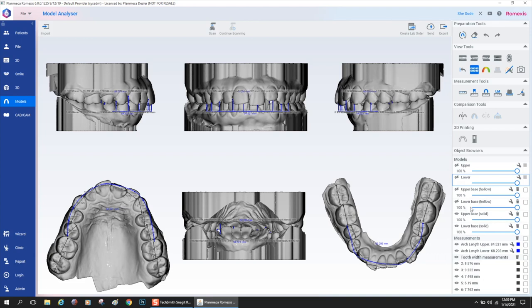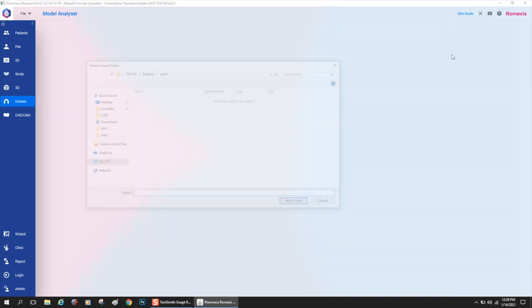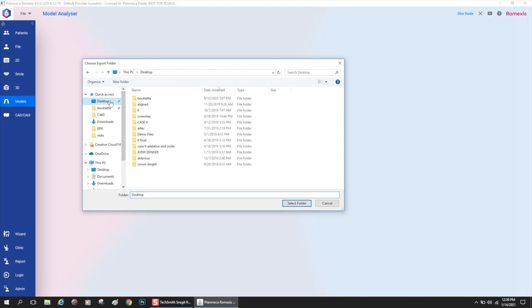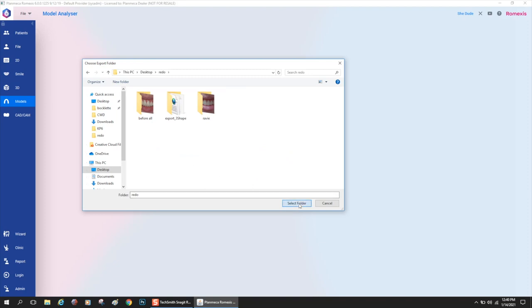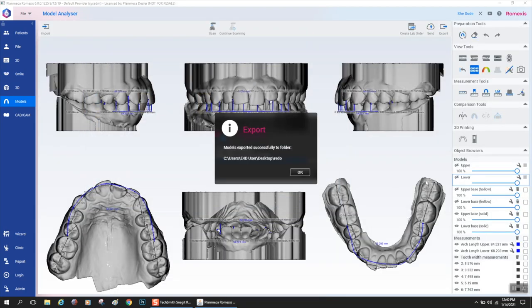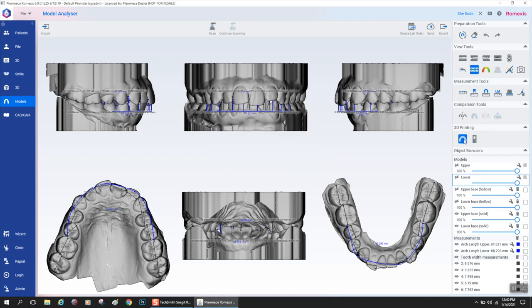So that's pretty much model analyzer in a nutshell. It's super easy to use. Once again, to get models out, just hit the export icon and save them to a folder and it's going to save everything for you to 3D print. So really simple. I hope you learned exactly what model analyzer is for. It's so that you don't have to put your models in mesh mixer and hollow and base. That's what I meant by death of mesh mixer. Thanks guys.